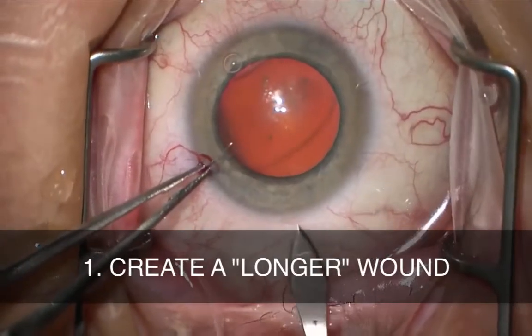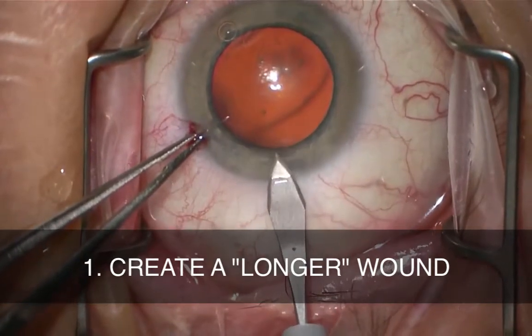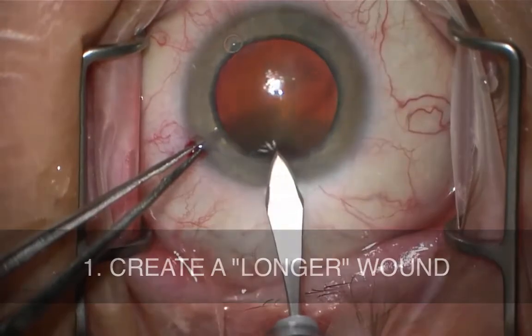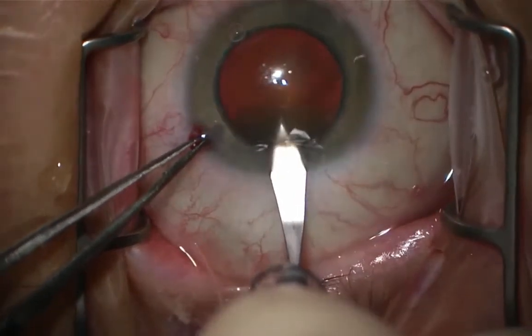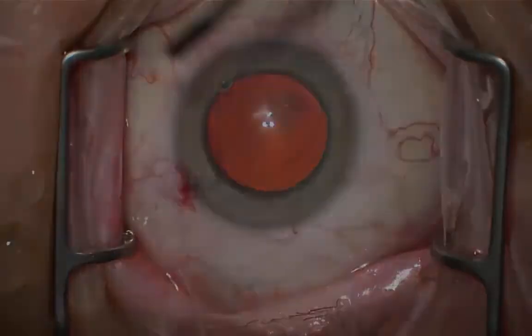Tip number one is to create a longer wound. One of the factors driving the pressure-driven movement of the iris to the wound is the distance from the iris to the internal opening of the corneal wound. If you are concerned about the potential for iris prolapse, consider making a slightly longer clear corneal wound.